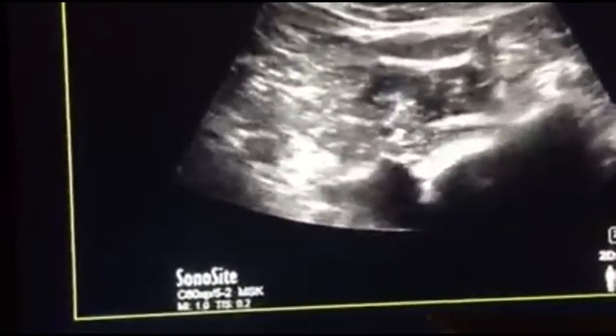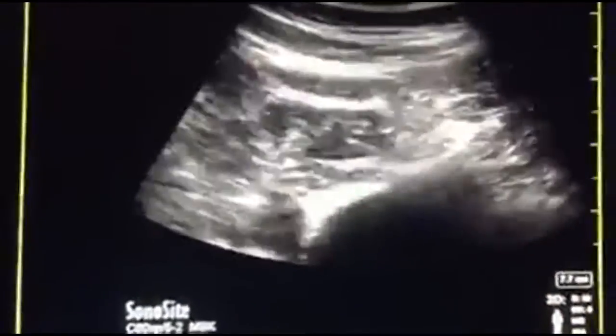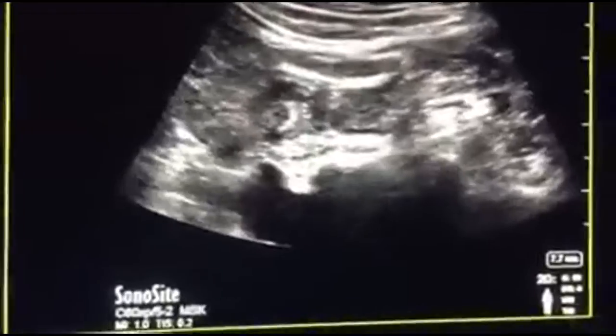I think somebody might have noticed the kidney here, just to show again. In the initial part, probably this is the kidney. Okay, so we are much below the kidney, avoiding the kidney. This is the video.